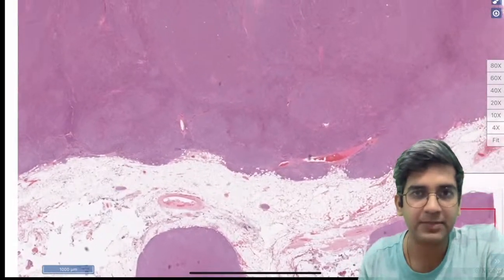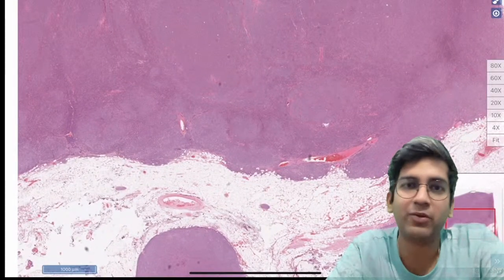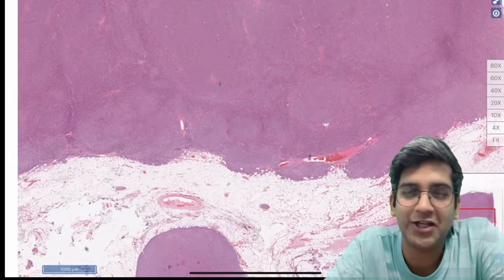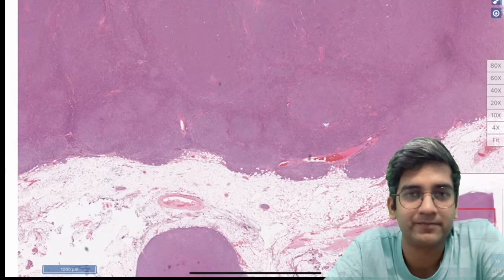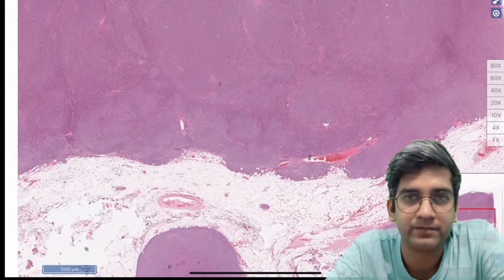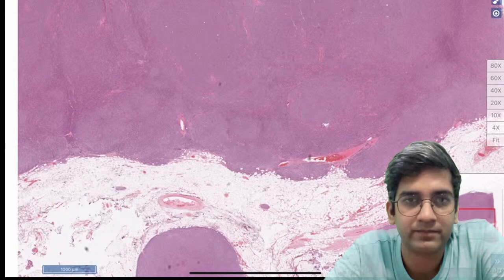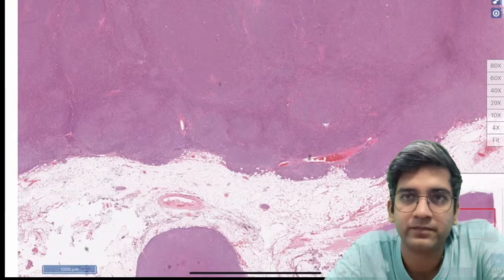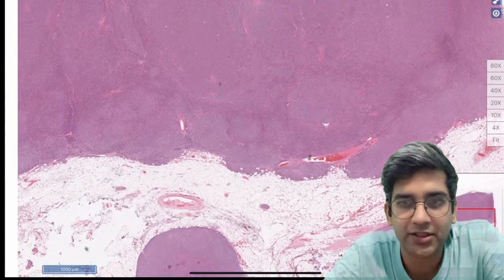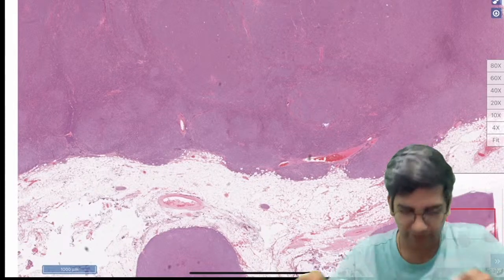As usual, tell me the organ. Go on, I want you guys to comment. I am not going to encourage any more unless you guys comment. What is the organ? It's a simple one. It's not a very difficult one at all. What is the organ? Janardhan is great. Bang on, it's a lymph node, right? Amazing. Fine. It's a lymph node.